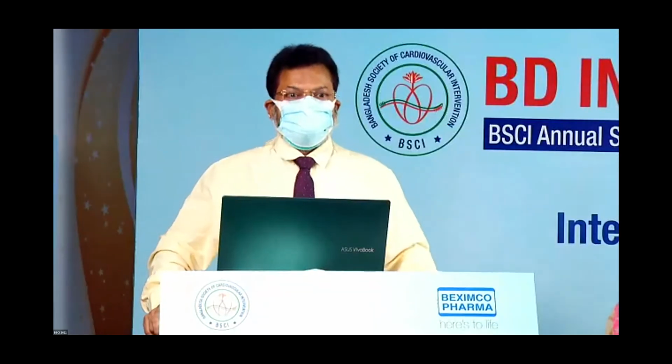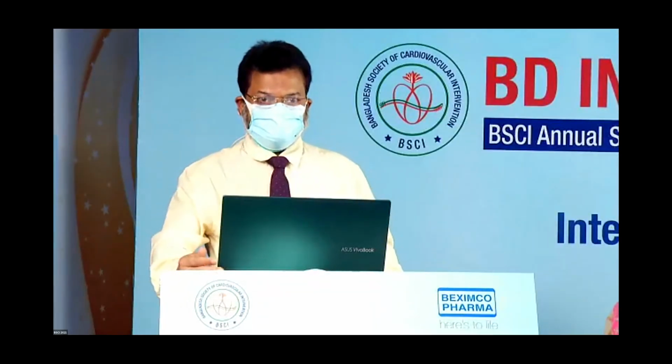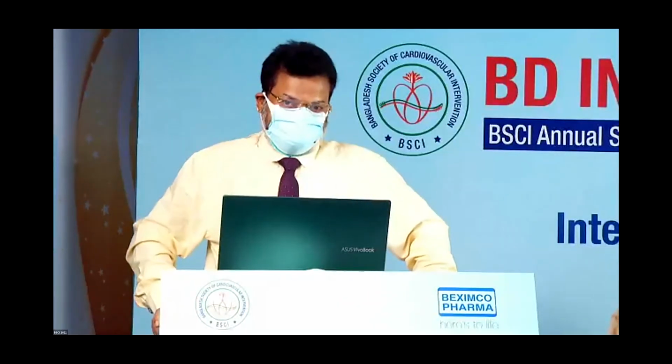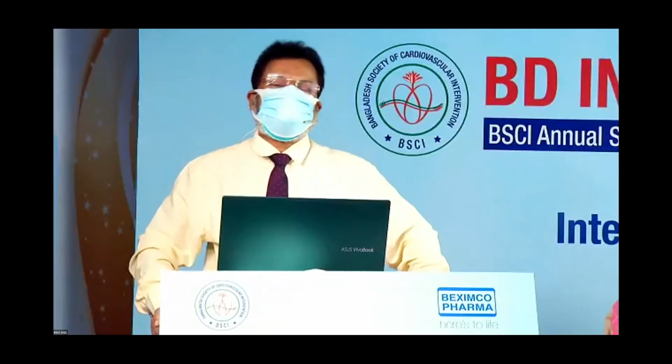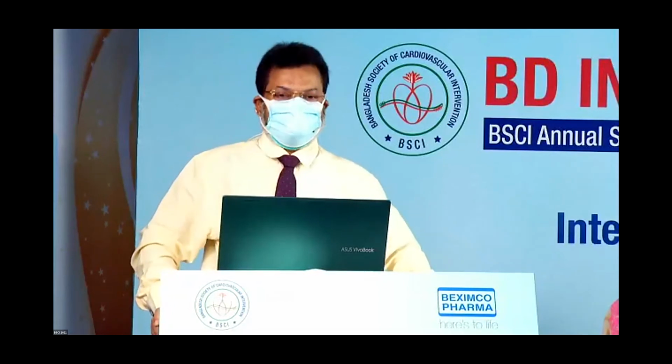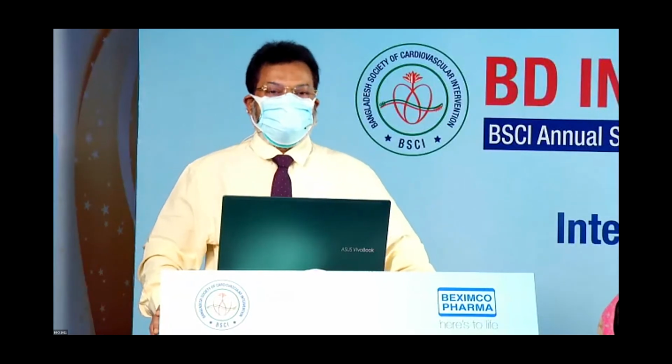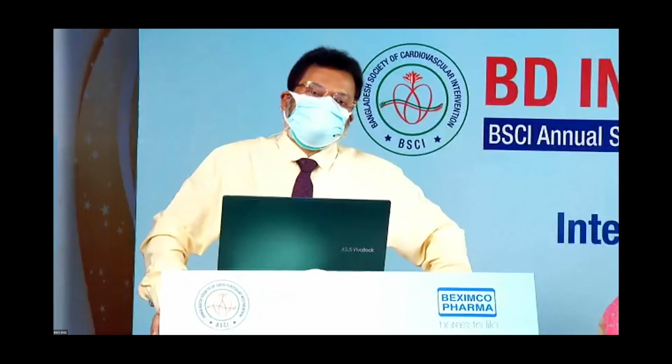Professor Rahman, have you seen my case? What could I do? What else could I do? After finishing with this mess, you have nothing else to do. Now you have to live that way. Exactly. From the very beginning, whenever I have seen this ghost shadow in the left main hanging outside, what should I do? What you have done is the perfect one, because that is the last resort you have. There was nothing else to do.